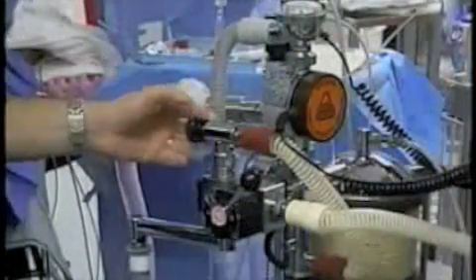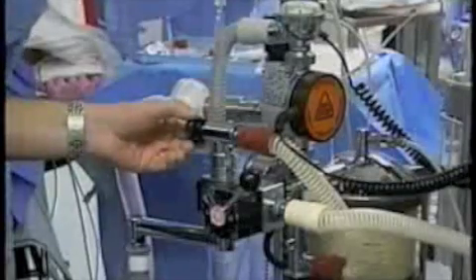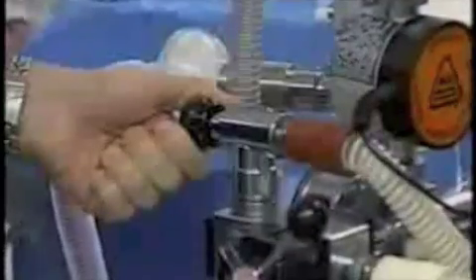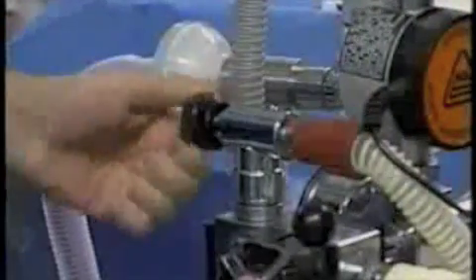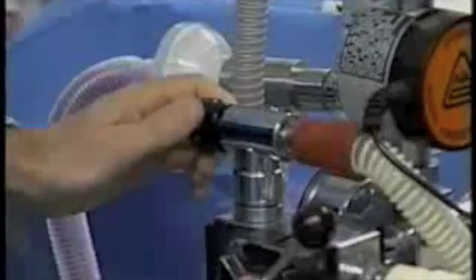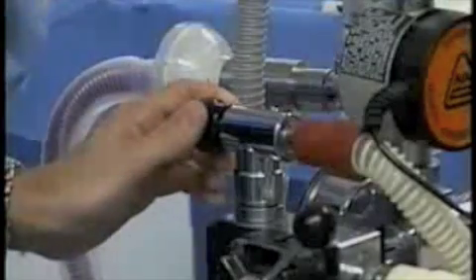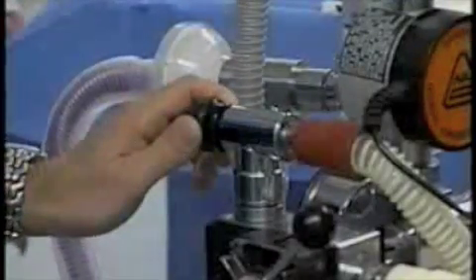The operating room is a good place to see some of these usability issues in action. This is called a pressure relief valve. It's used to vent excess gas in the system. When it's closed, the gas stays in the system. When it's open, it's vented. There have been a number of situations where this valve was closed without the clinician appreciating it, and the excess pressure in the system caused trauma to the patient's lungs.